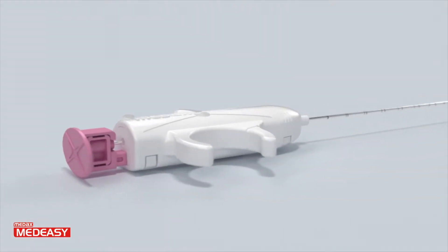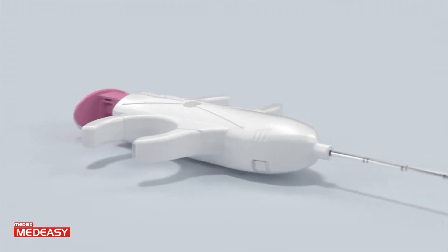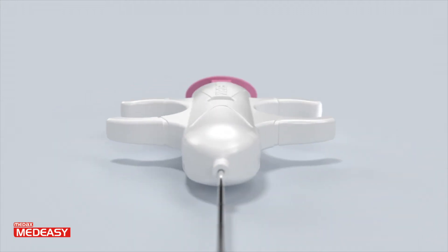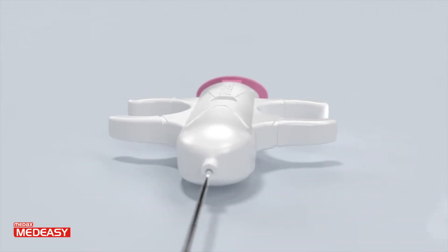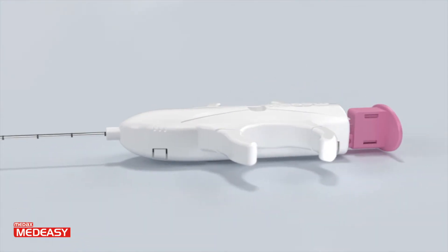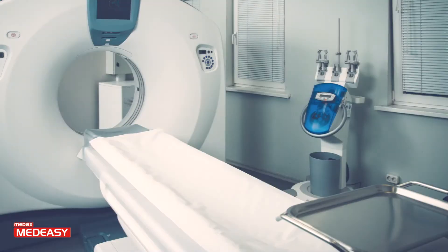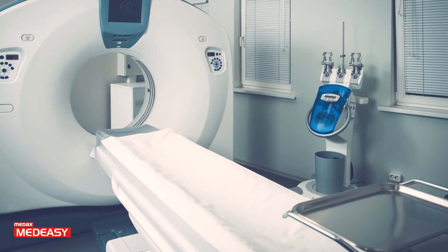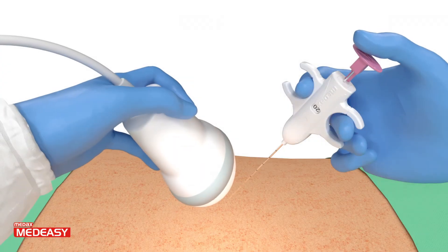Lightweight and ergonomic design make MedEasy reliable for accurate penetration, precise control, quality sample capability, and high performance under CT scan and other imaging guidance.